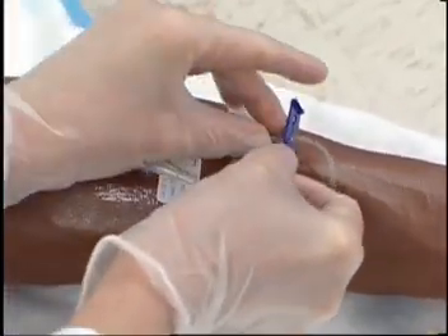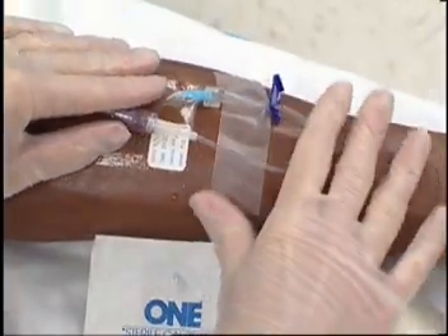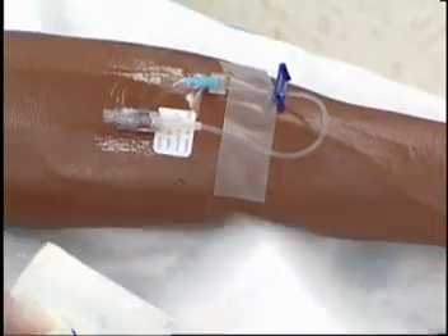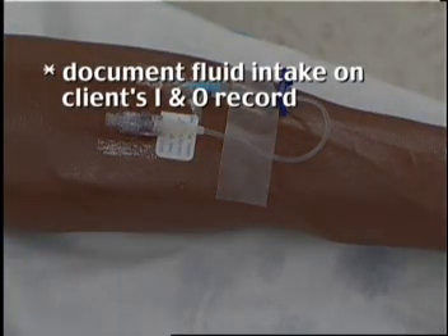Secure the saline lock with tape. Document fluid intake on the client's I and O record.